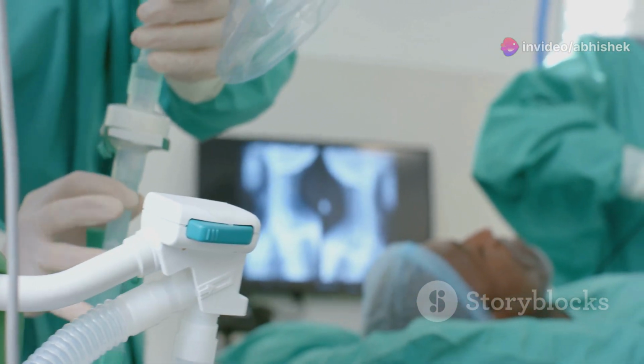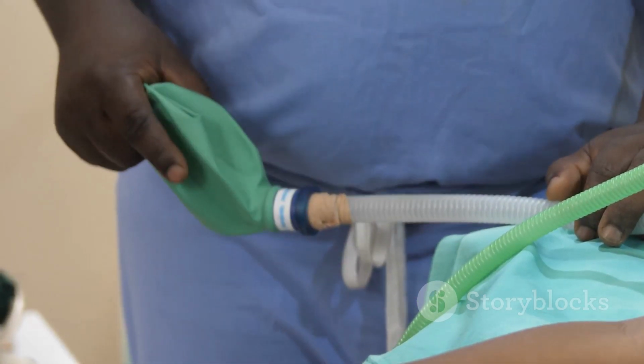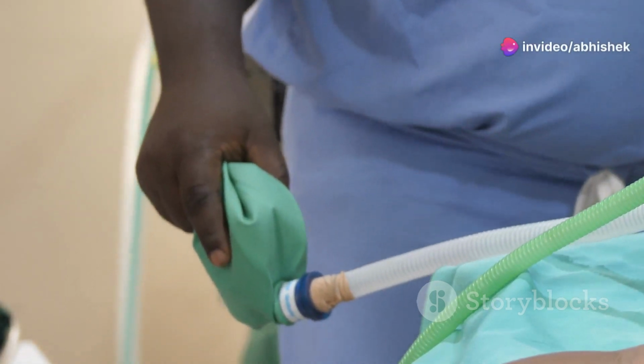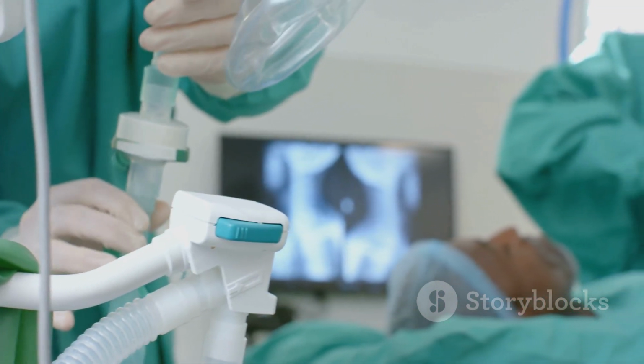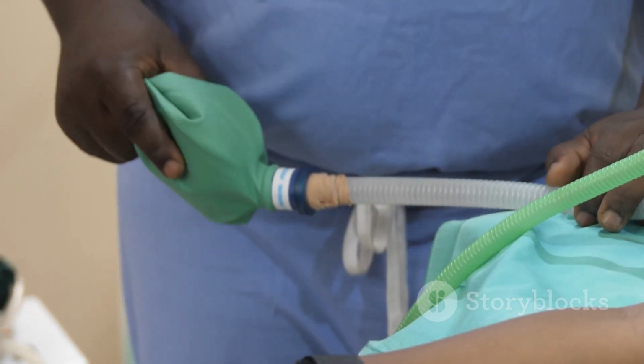The final component we'll discuss today is the suction system. This might not be the most glamorous part of the anesthesia machine, but it's certainly essential for maintaining a clear airway. During surgery, patients can't cough or clear their throats like they normally would, so we need a way to remove any secretions or fluids that might build up. That's where the suction system comes in.